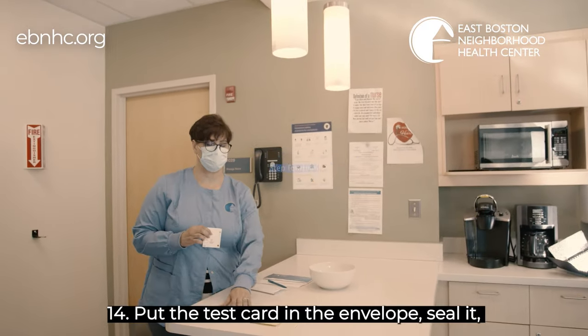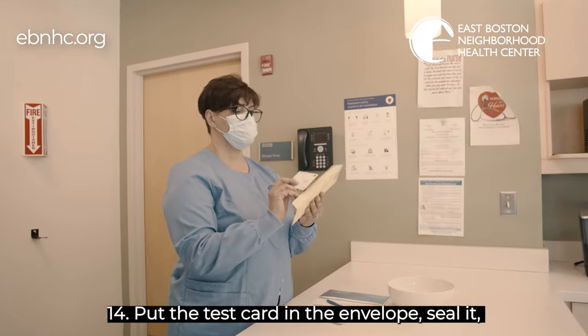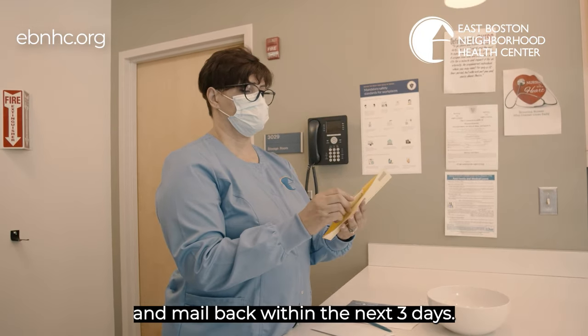Step 14: Put the test card in the envelope, seal it, and mail back within the next three days.